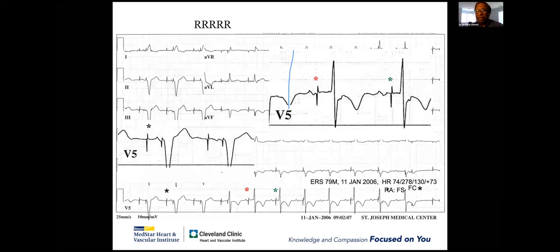Well, this is what happened. Short PPM. As this is not sensing the atrium, it is pacing the atrium. And there is a feature built into the pacemaker that if after atrial pacing there is any sensed ventricular event, it will pace the ventricle at a short interval of 110 milliseconds, which is called safety window pacing or the 110 phenomenon. Now, this phenomenon was very, very important in the days when we had unipolar pacing.